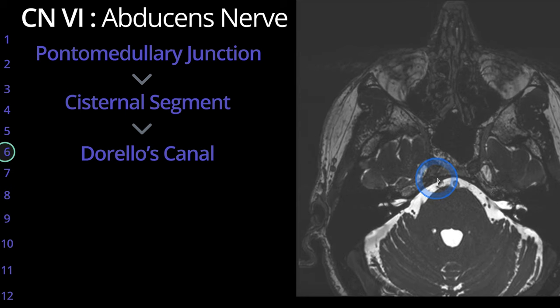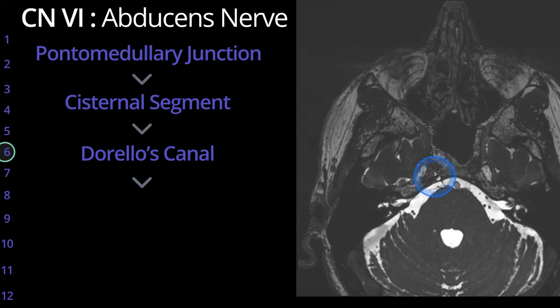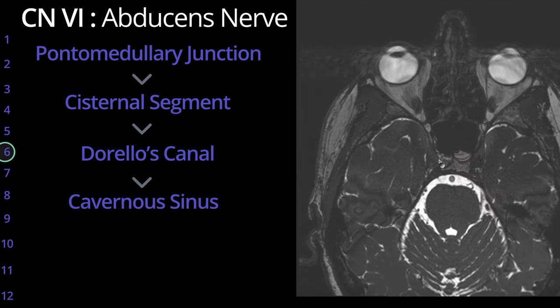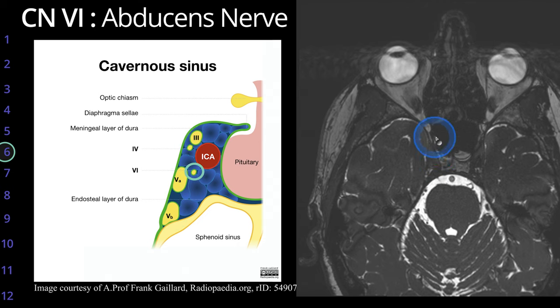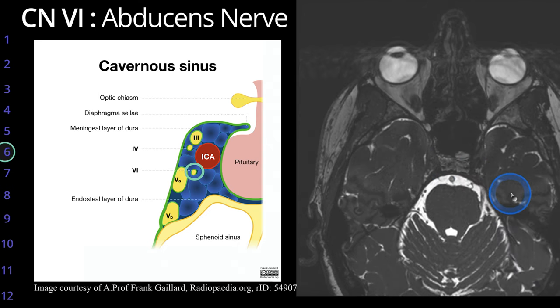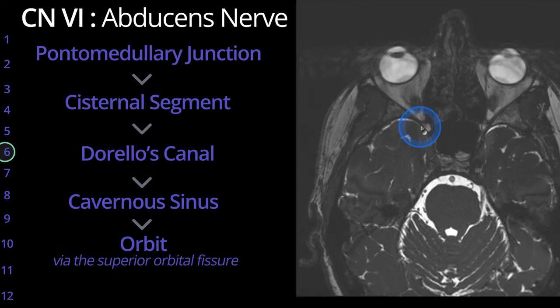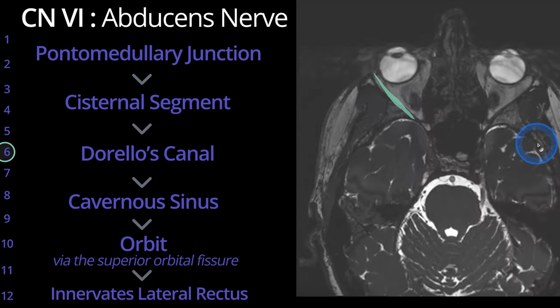We then lose good visualization of the cranial nerve on this sequence. However, we know it passes anteriorly through the cavernous sinus proper. While cranial nerves 3, 4, and the ophthalmic and maxillary divisions of cranial nerve 5 pass along the lateral wall of the cavernous sinus, cranial nerve 6 actually passes through the cavernous sinus proper, the only cranial nerve to do so. It exits into the orbit through the superior orbital fissure and innervates the lateral rectus muscle.